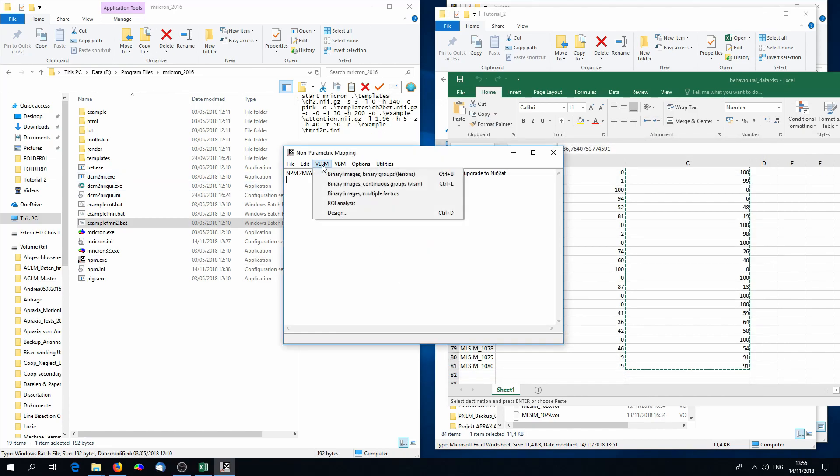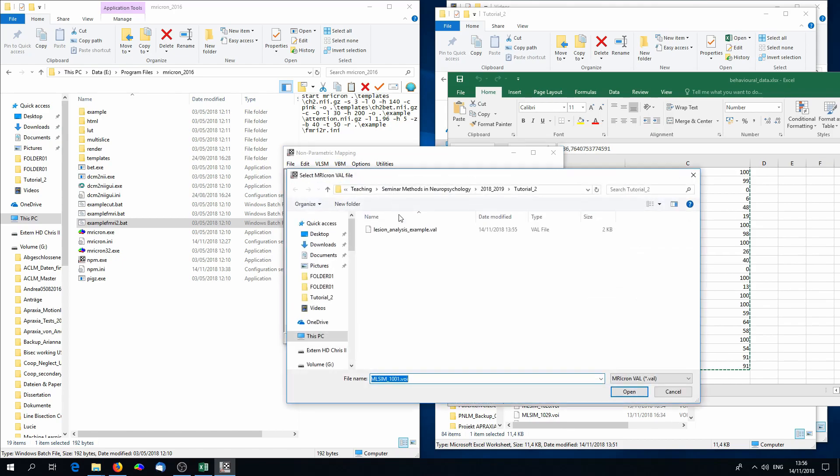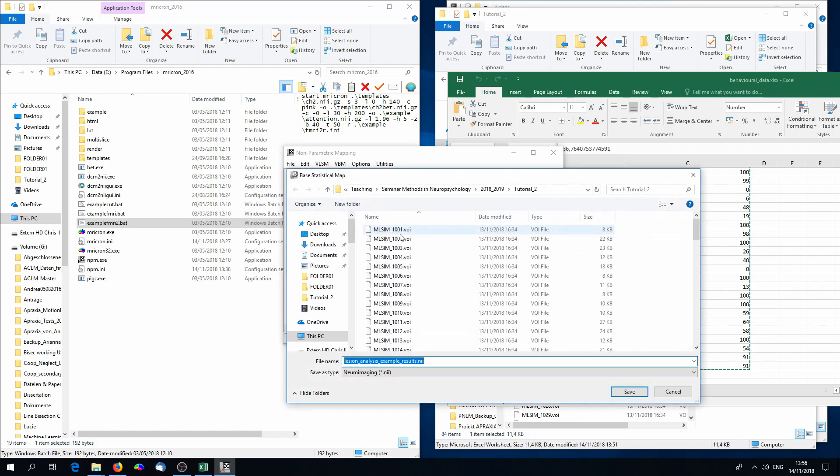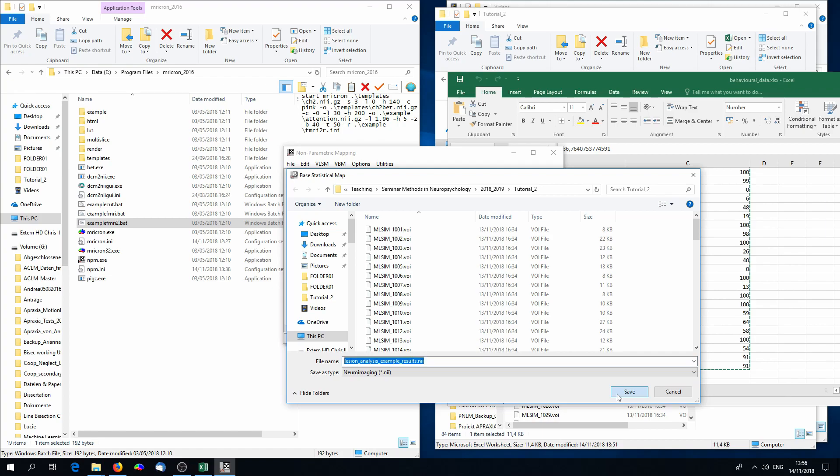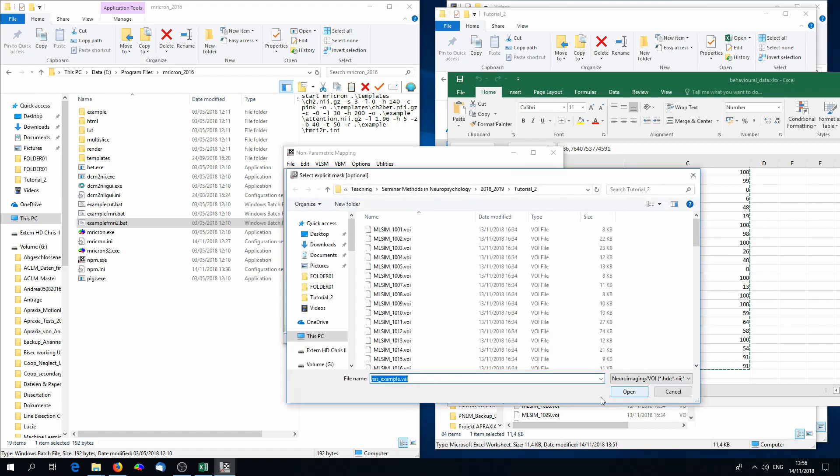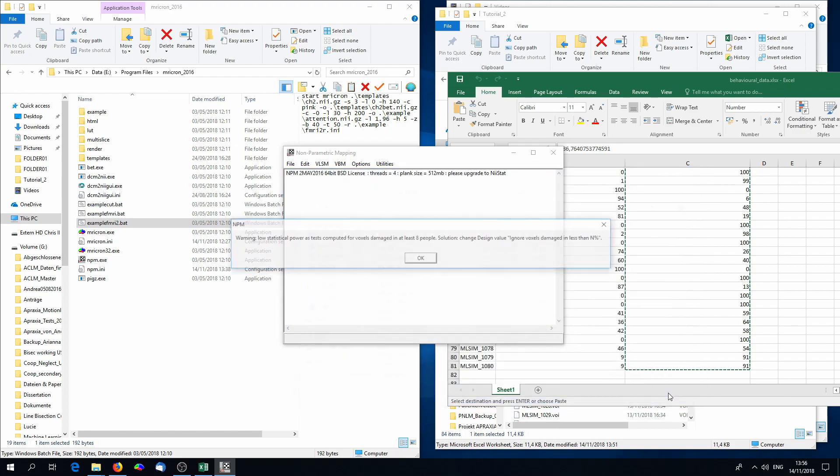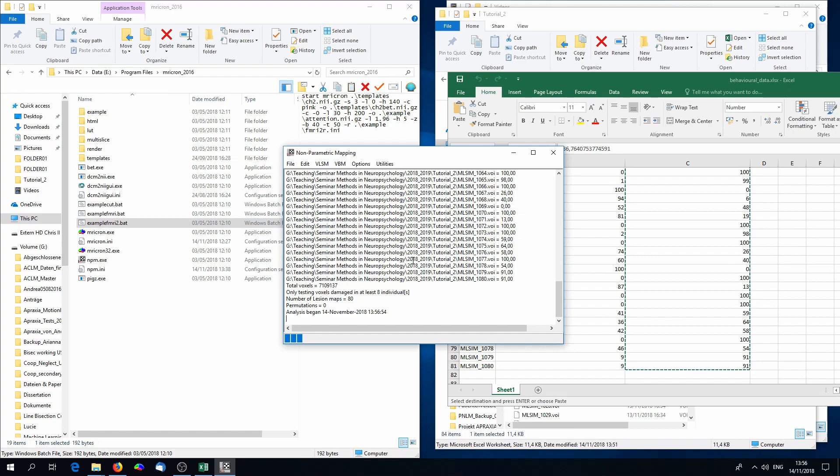Now we can perform the analysis by clicking on VLSM, Binary Images, Continuous Groups. Click on the .val file we just produced, and then we can select what the output file should be called. We can just choose the default, click on Save, and the next window will ask if we need an explicit mask. We do not need it, so just click on Cancel. You can ignore this warning, and afterwards, the analysis starts.